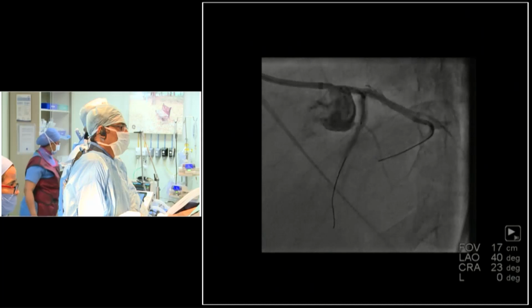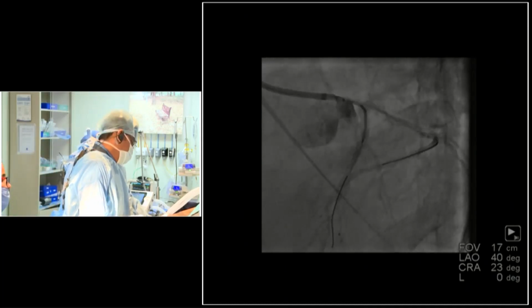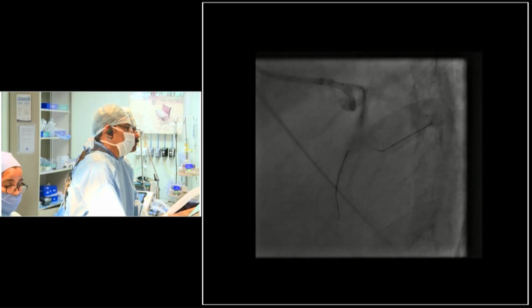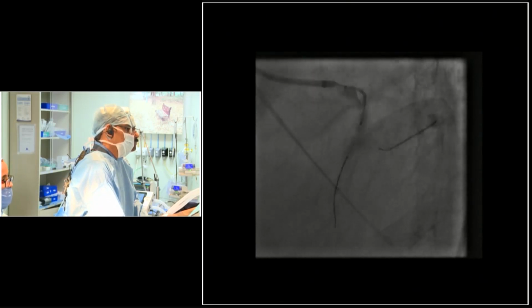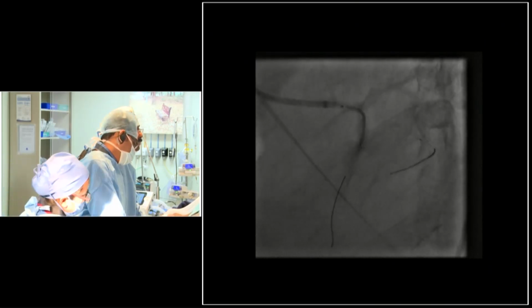But the overlapping is too much, I think. Yeah, it is too much. We could have taken a shorter stent. I know. We measured only 45 something. Totally measured after that 44, 34, we should have taken a longer stent. Already you have put 32, isn't it? Yeah, and no, 44. Then you have to include a left main also, some 8 millimeters. Maybe we could have taken a 23 something.